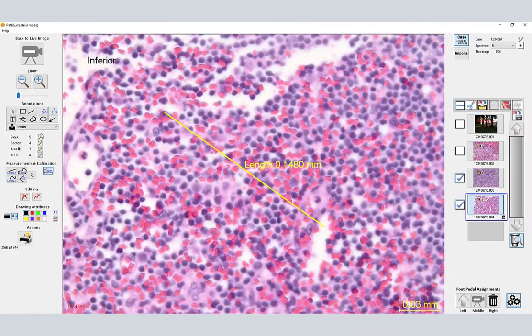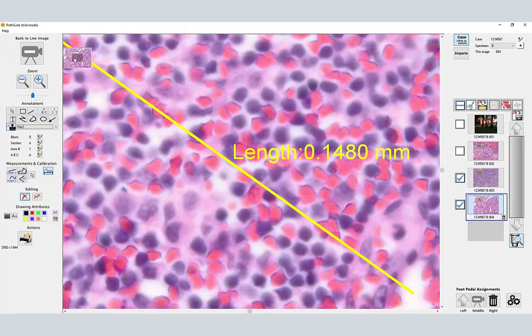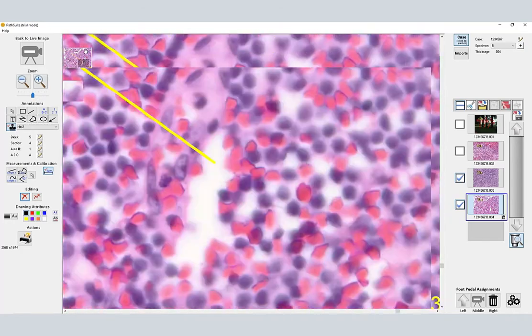And at that point, I can just go back over here, and if this was my HER2 image, I can go get my HER2, which probably should have been capitals, but that's that. So this is really the PathSuite software interface for microscopy. It very much mimics the grossing, same interface, but slightly different controls. And then the other thing we have here is, when you have a captured image, you can zoom in and walk around on the image.